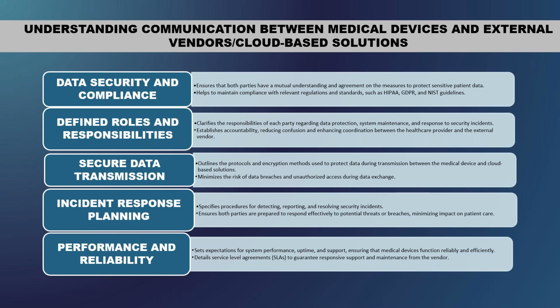So we talked about the MOU and ISA. It's really important, since your data is going to be accessed by a vendor or external connection, to identify the memorandum of understanding or develop some type of policy for how they're going to have access, what they have access to, the credentials, and knowing their backup. If data is being stored, I once saw a vendor storing the data in a database, and I asked them how long they had been purging the data. They said it's been there forever. That's an issue, because all your data is being stored externally, right?